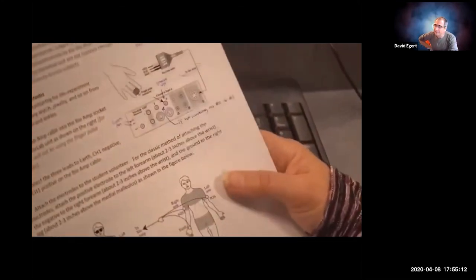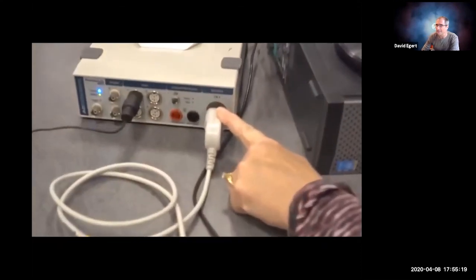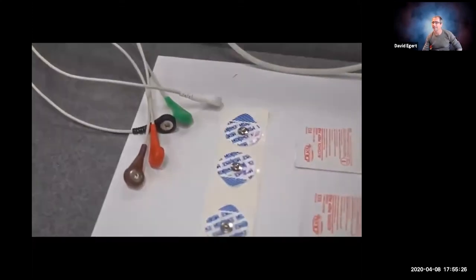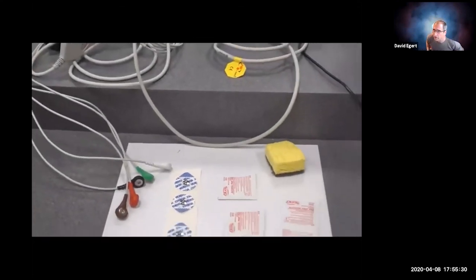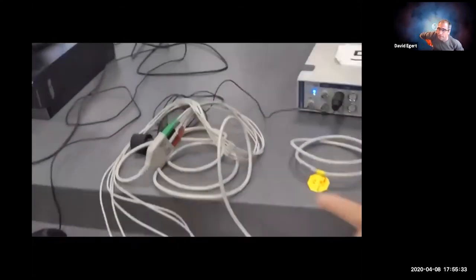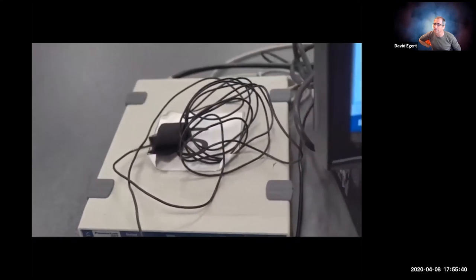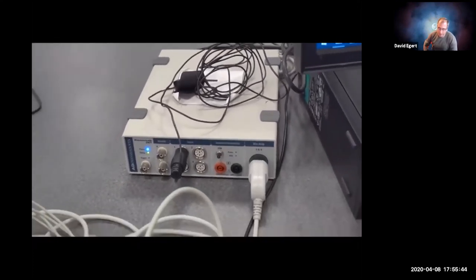All right, removing jewelry, watch, plug the bioamp cable into the bioamp socket. I'm going to show how that actually goes. Connect the 3 leads to earth, ground. Those little things with the snaps, those are the electrodes. Pulse transducer, you can actually pick that up. So this will be for later, not for the EKG. This is for looking at pulses.